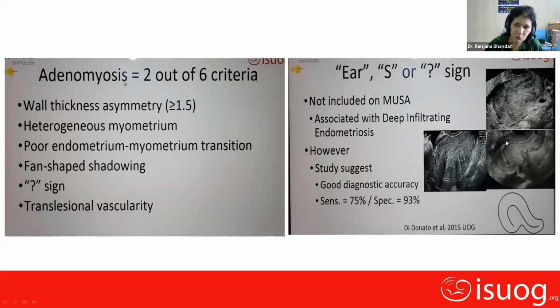So this is giving a question mark sign. The uterine body is looking up, and it forms a question mark because the anterior portion of the cervix is towards the endometrial cavity. It is an anteverted uterus, but retroflexed, because this is the flexion.